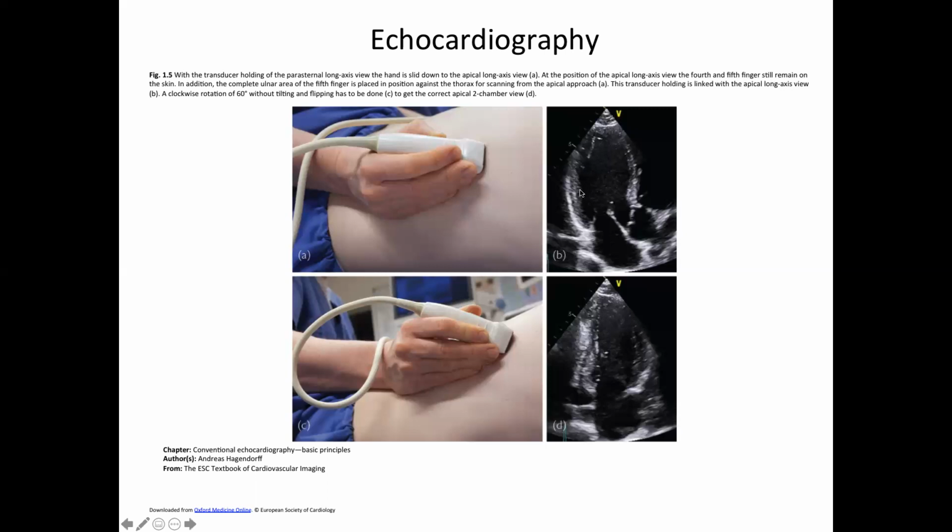You can see the characteristics of an ultrasound image. It's kind of noisy, right? It's a little bit confusing unless you know what you're looking at, because it's not an anatomy book drawing. With some CT images and MR images, you know exactly what you're looking at because it resembles the anatomy so much.